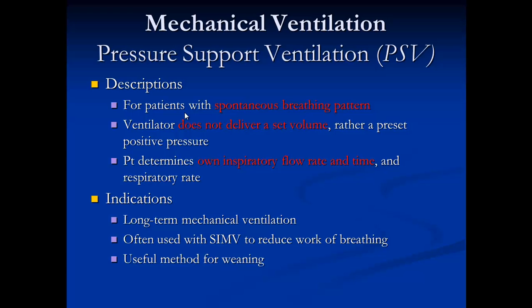Pressure support ventilation provides a preset level of inspiratory pressure and assists with each spontaneous breath. This inspiratory assist is selected to overcome the increased work of breathing imposed by any disease process.